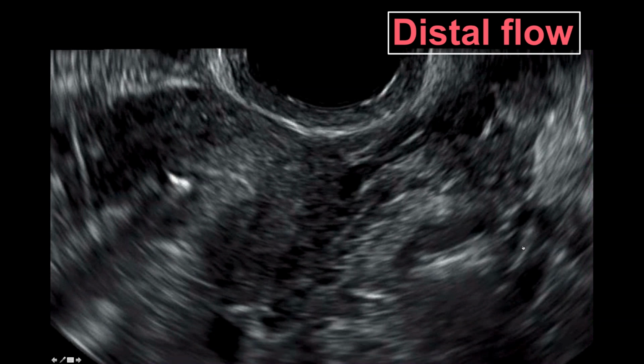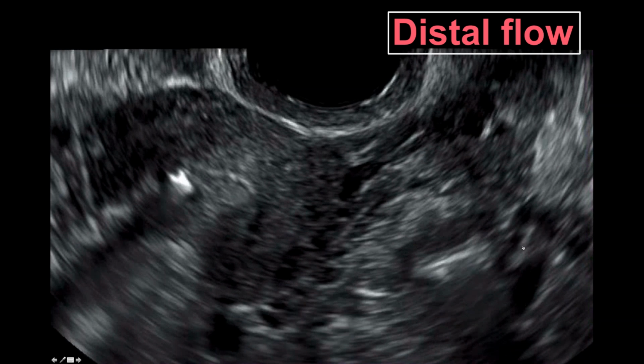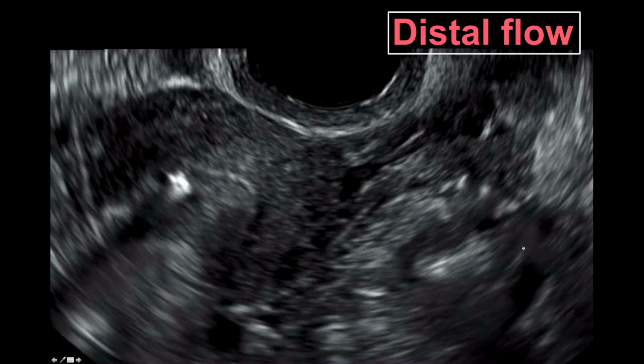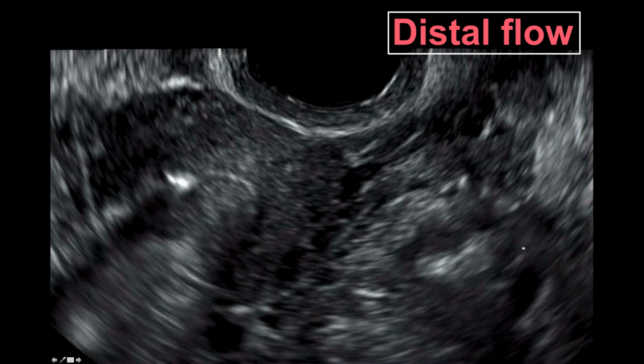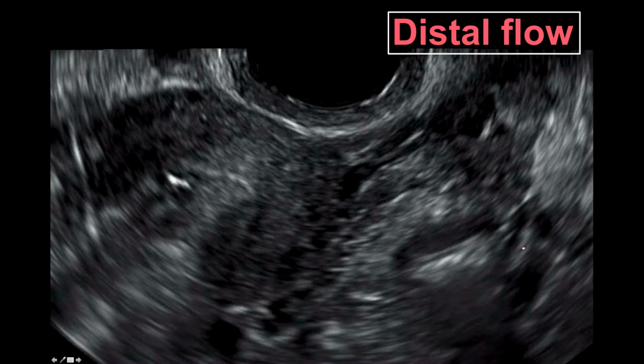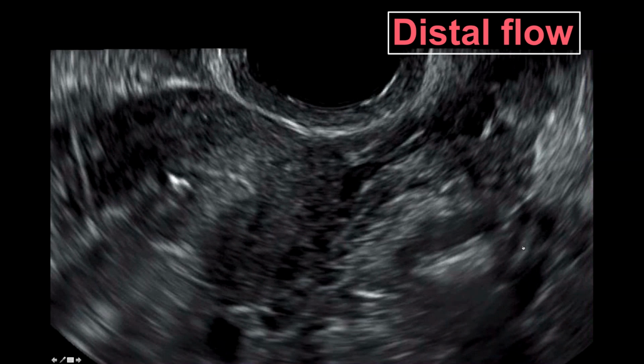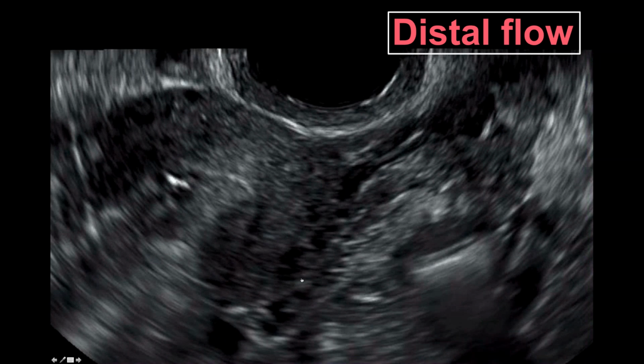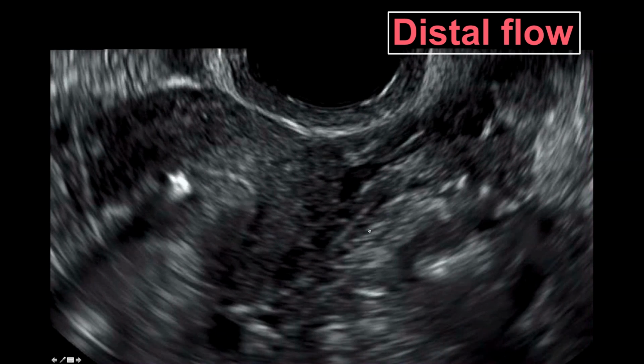So in our protocol, we always start out by trying to see both tubes at once, if we can get that view lined up. If not, we focus first on one side. Typically, I look at the side that I think is going to be the easiest to see, and then we focus on the other side. If I don't see air bubbles coming out from the cornu or somewhere around the broad ligament, then we focus lastly around the ovary. And somewhere there, you should see it.